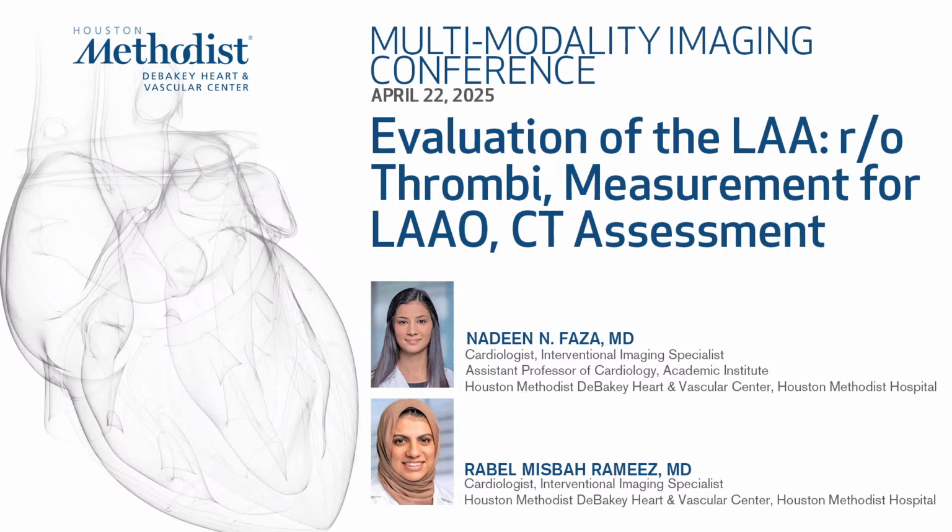All right. Good afternoon, everyone, and welcome to our multimodality imaging conference. Today, we're going to be discussing evaluation of the left atrial appendage from the multimodality standpoint. So I'll be discussing the echo evaluation. Dr. Rameez will be discussing CT evaluation, and Dr. Sherman will be discussing ICE evaluation.